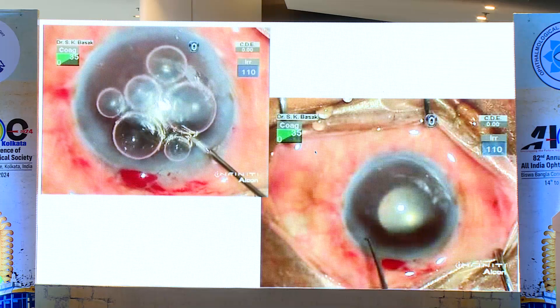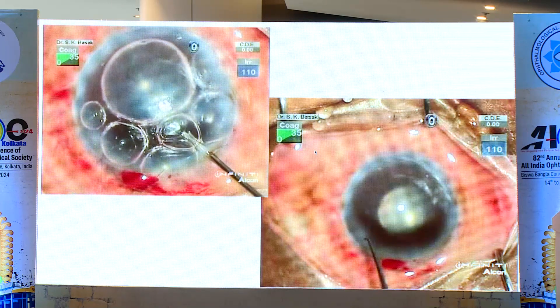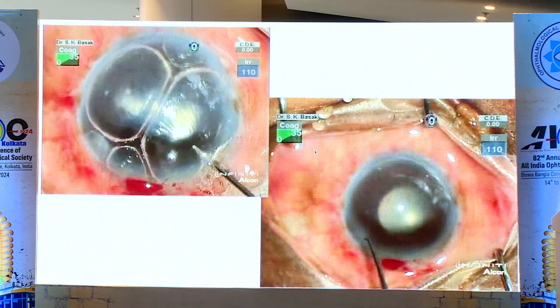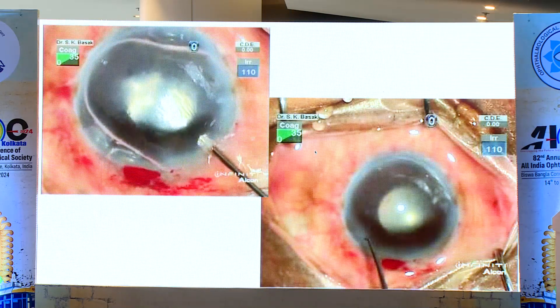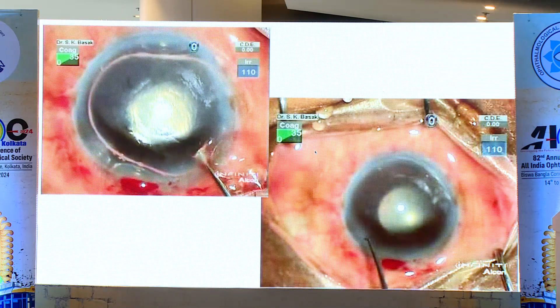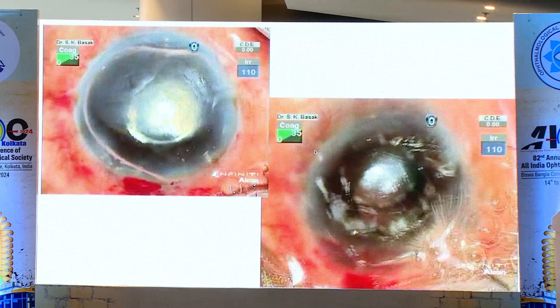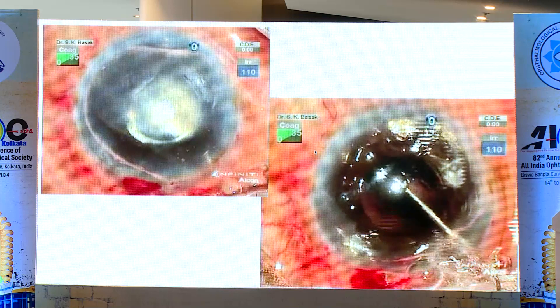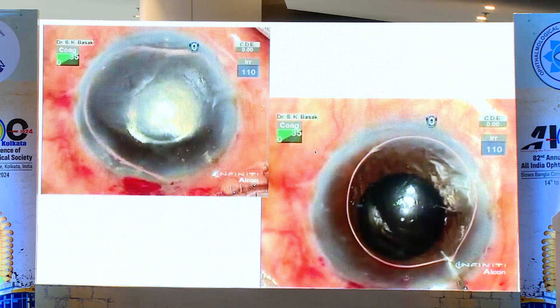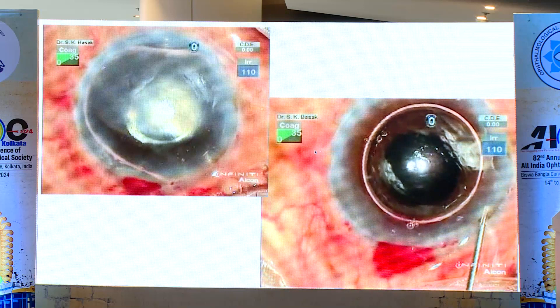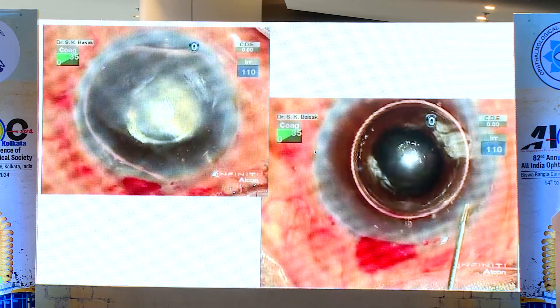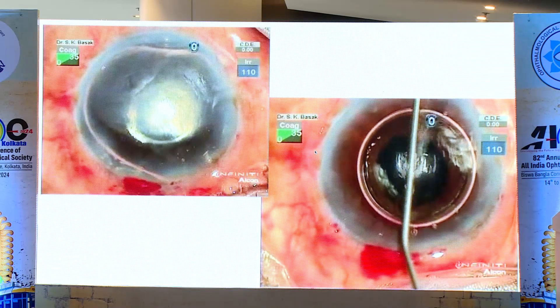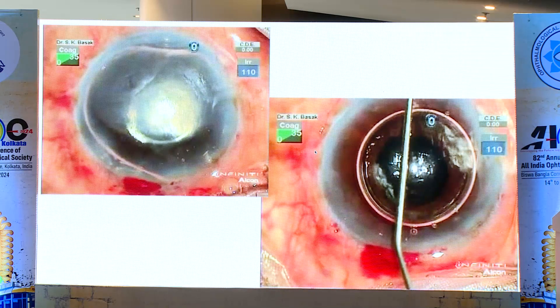I made a side port, since the vertical detachment was not very extensive, and injected air. This is the power of air — all endothelial surgery depends on the power of air, whether you go for DMEK, DSAEK, or repair of Descemet's detachment. You make the air bubble absolutely tight. If you make it very tight, wait 30 minutes, then you can release some amount of air.